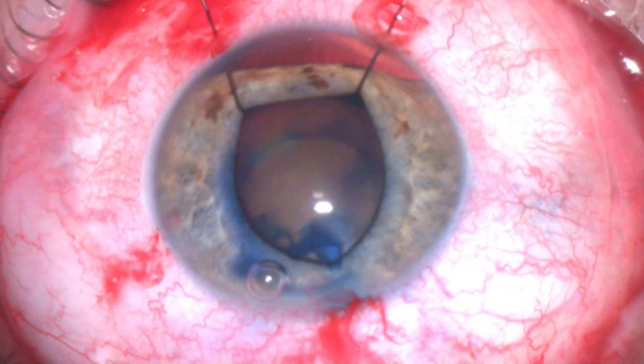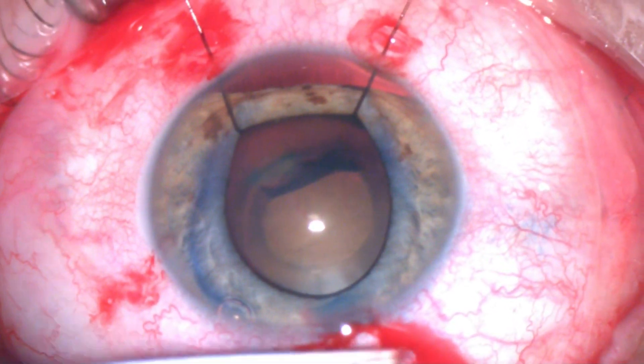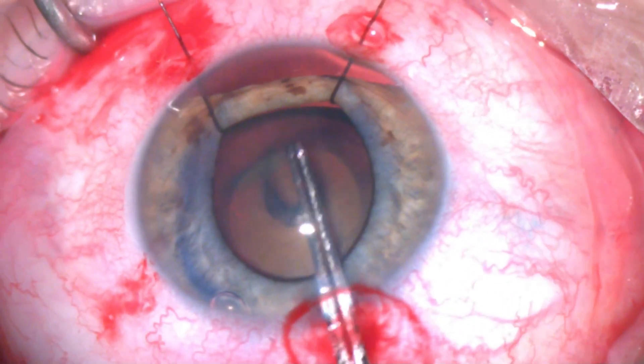Aiming for about five millimeters, I'll inject a little bit extra viscoelastic and try to extend the capsulorhexis here to reach the appropriate size of about five millimeters.